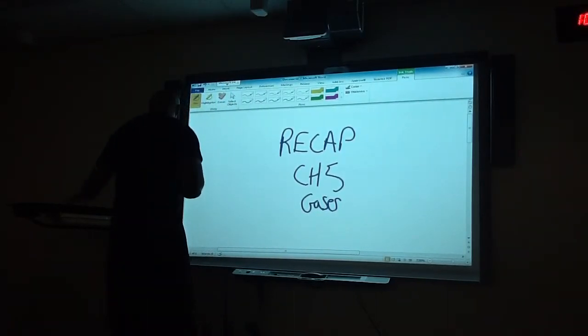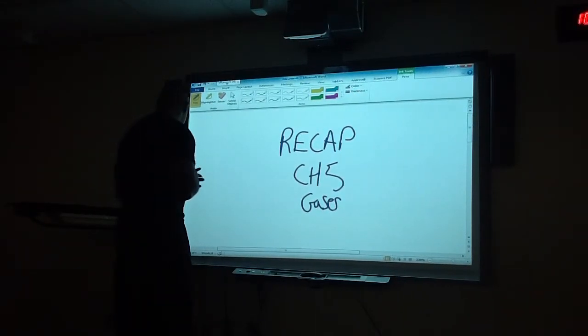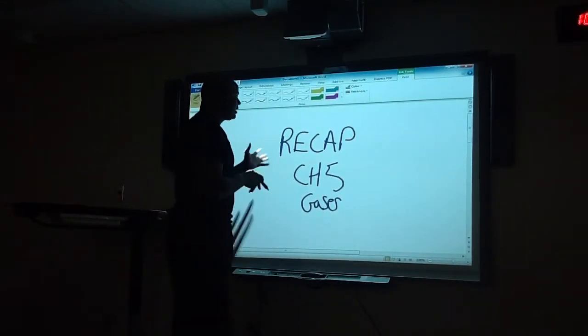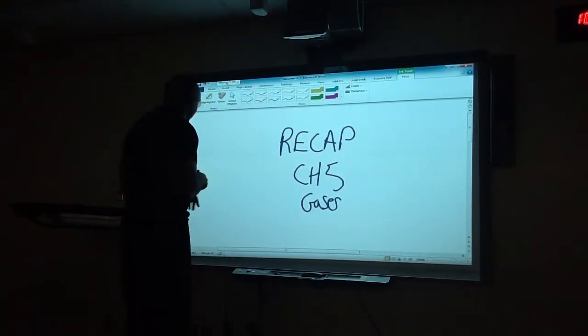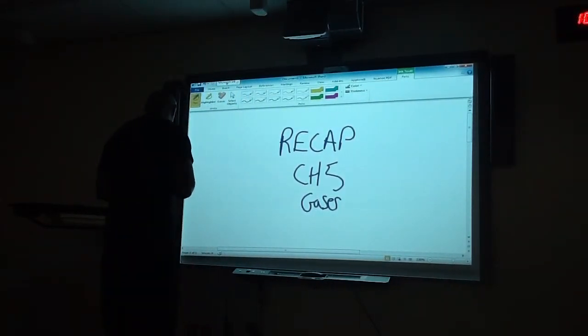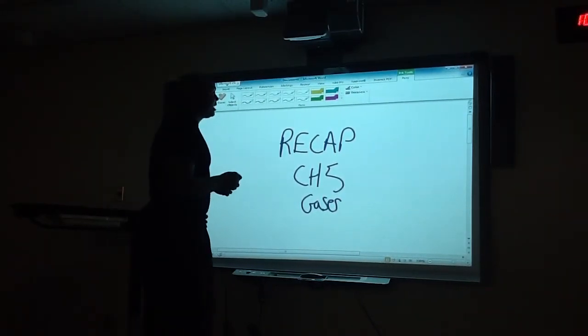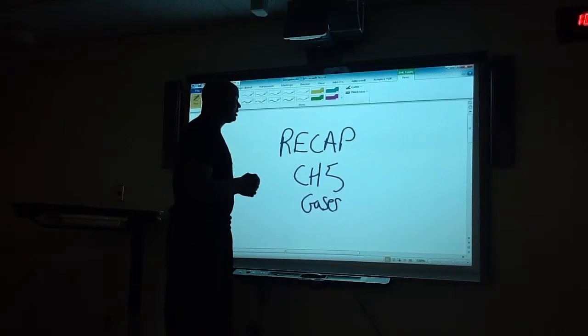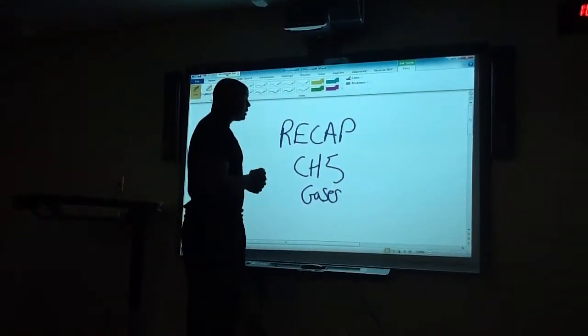And we talked about blood pressure as far as the first reading that we get and the second reading that we get, which is the systolic and the diastolic. And we also talked about how the pressure works internally inside of the manometer to give us that ability to gauge the pressure in blood.